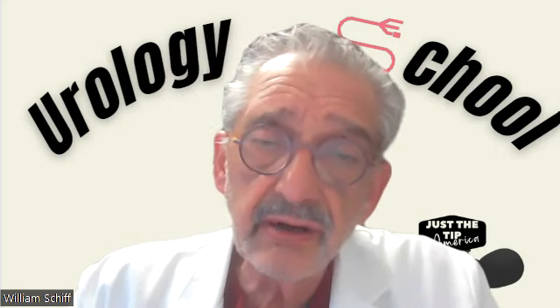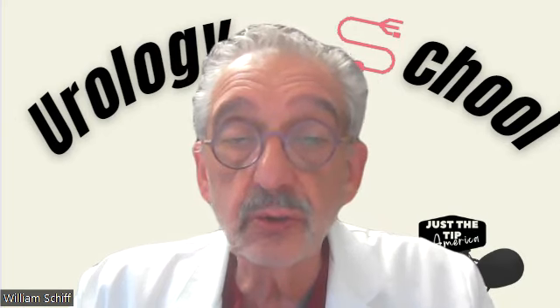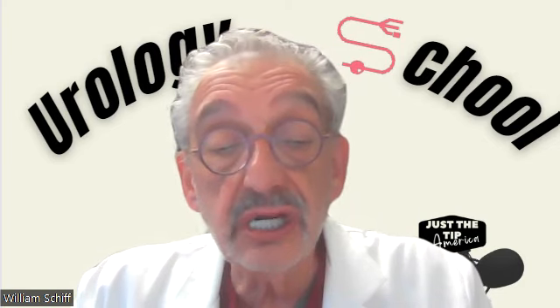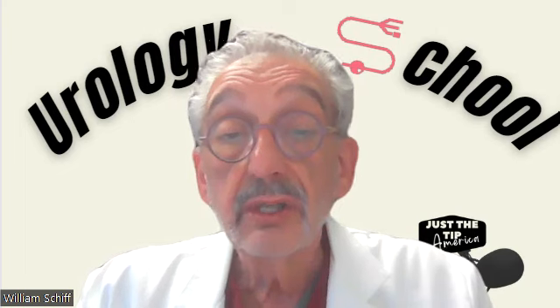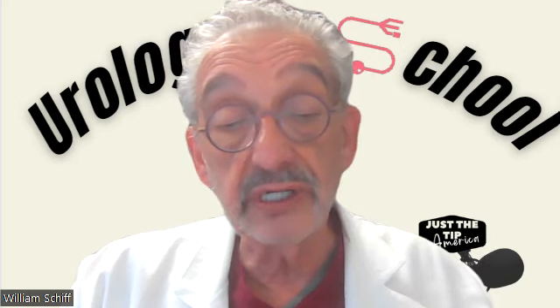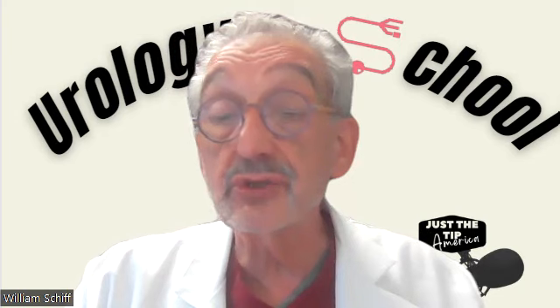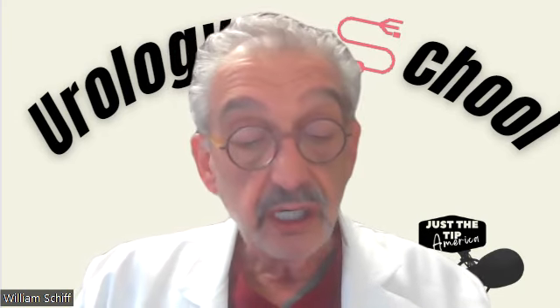We're seeing a lot of use of MRIs, diffusion weighted for prostate cancer, looking at PI-RADS scoring, level of 1 through 5. The higher the number, the more suggestive of significant prostate cancer it is. It is great for staging for patients with high risk prostate cancer.